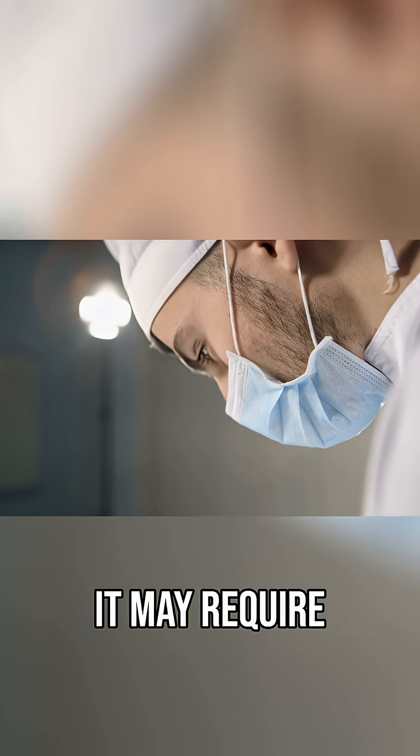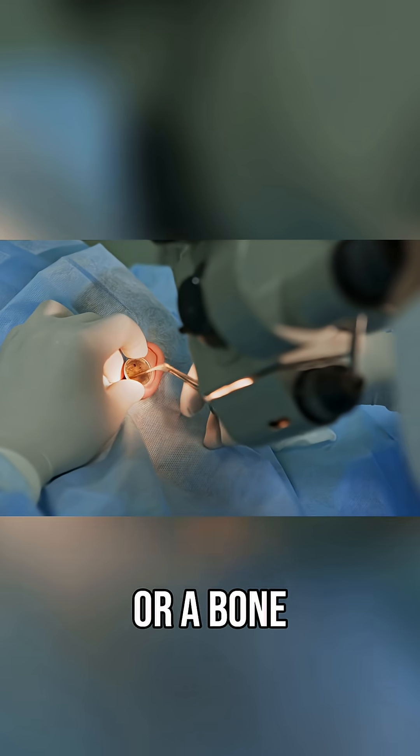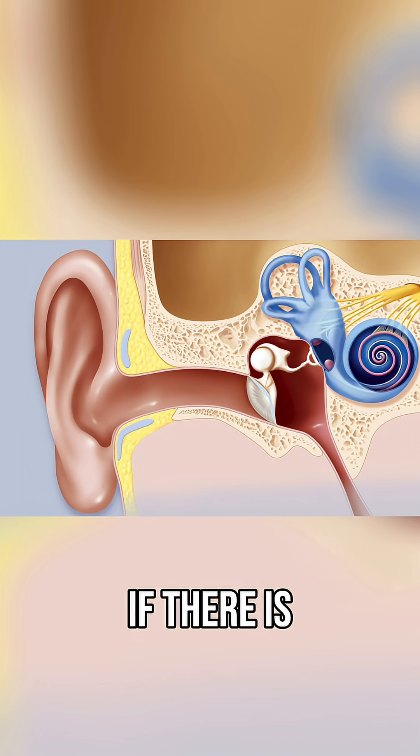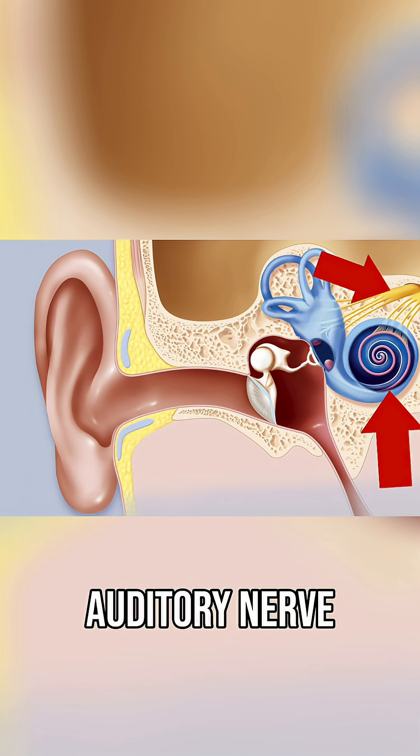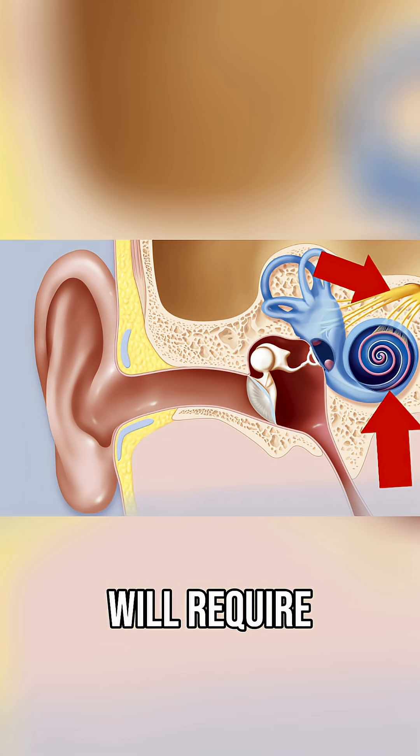To correct for this, it may require surgery, medical intervention, or a bone conduction hearing aid. If there is no gap between the air conduction thresholds and the bone conduction thresholds, the issue is either within your cochlea, which is your hearing organ, or along the auditory nerve up to your brain, and will require either hearing aids or a cochlear implant to treat.